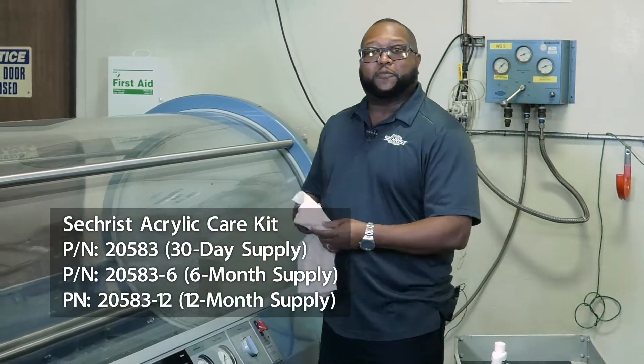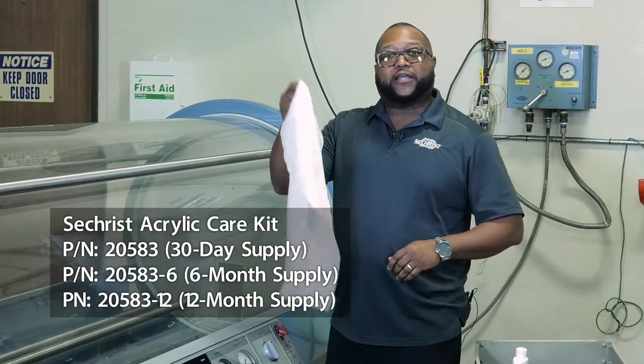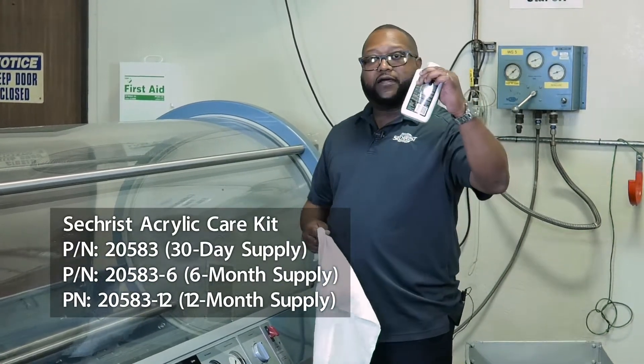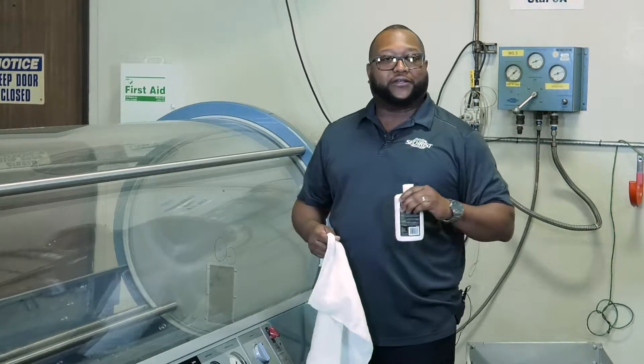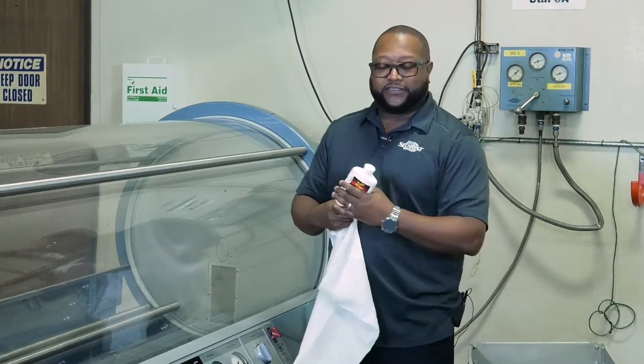It's a very simple process. This kit comes with a cloth diaper that we'll use for polishing and our clear plastic cleaner, which is a Meguiar's product number 17. And again, that's going to be listed.